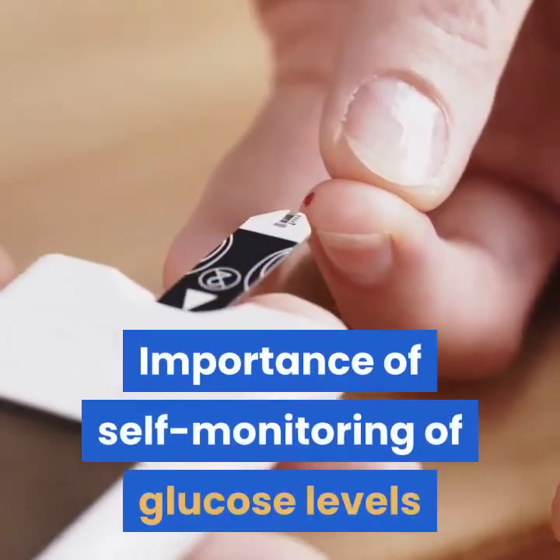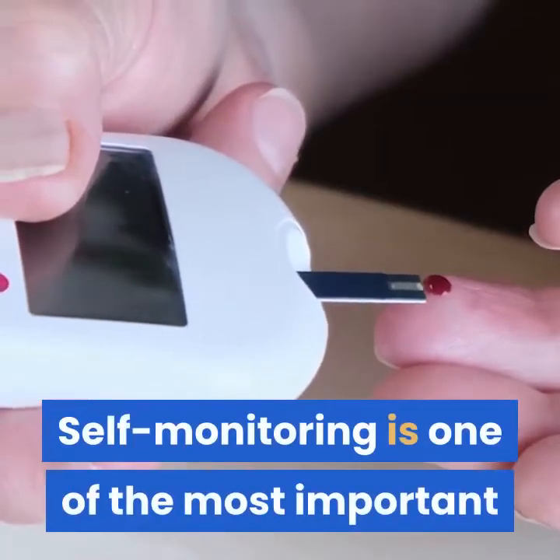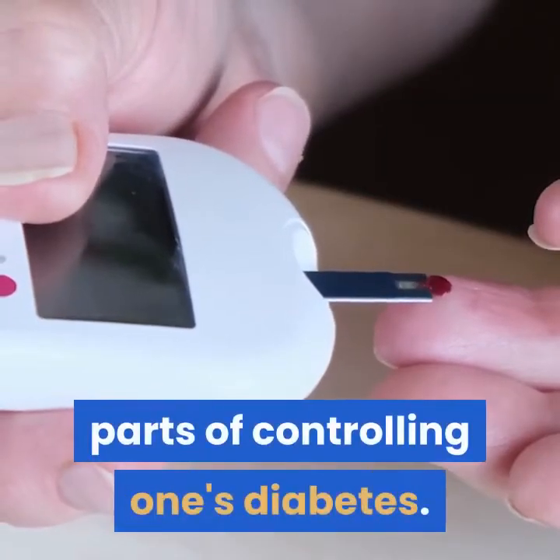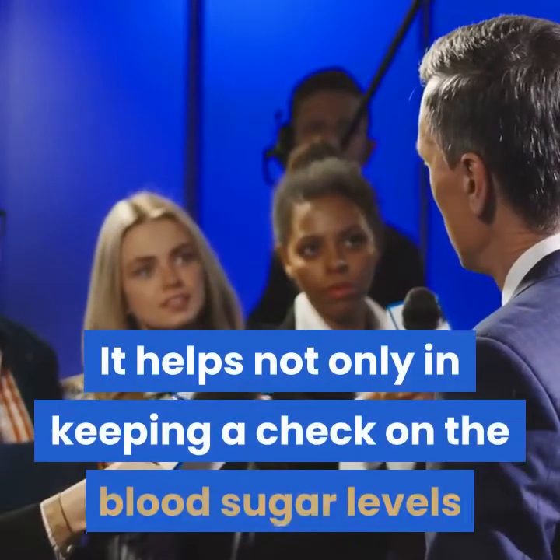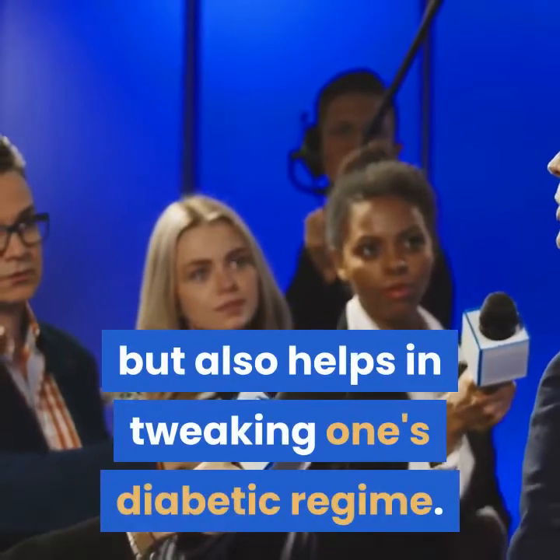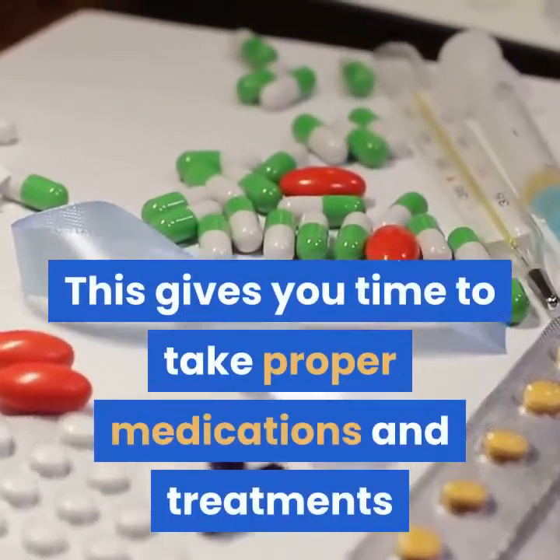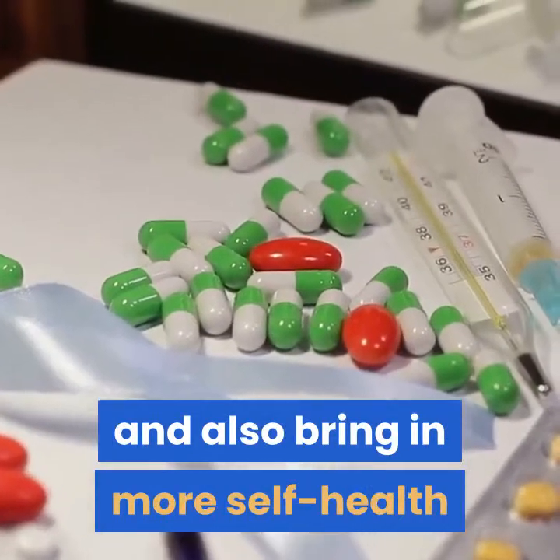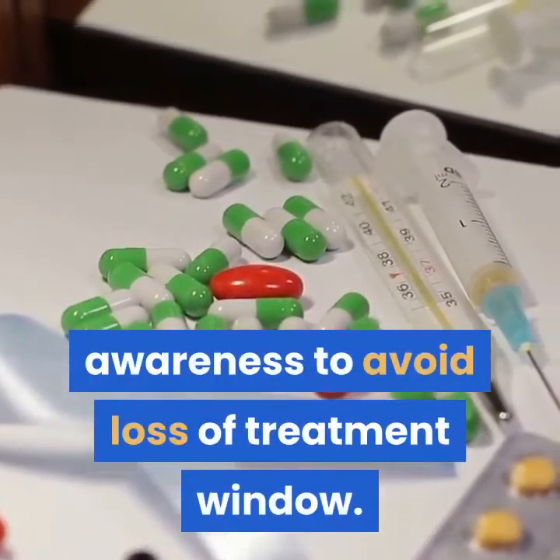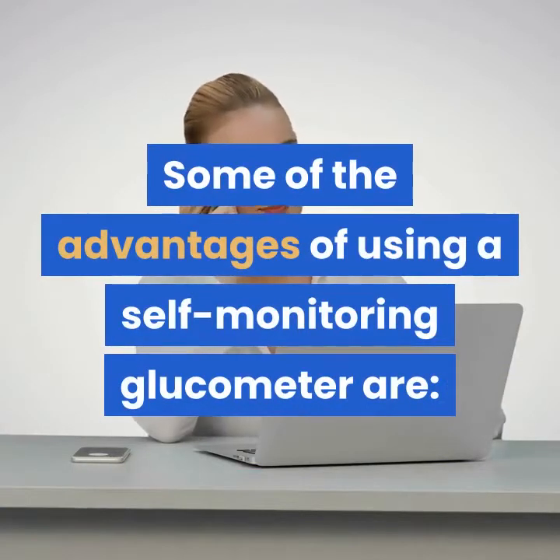Self-monitoring is one of the most important parts of controlling one's diabetes. It helps not only in keeping a check on blood sugar levels but also in tweaking one's diabetic regime. This gives you time to take proper medications and treatments, and also brings more self-health awareness to avoid loss of treatment window. Some of the advantages of using a self-monitoring glucometer are as follows.